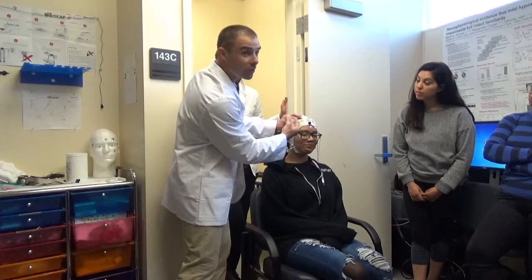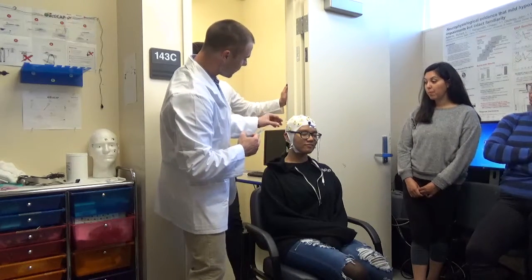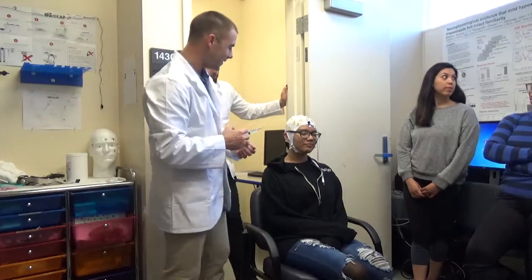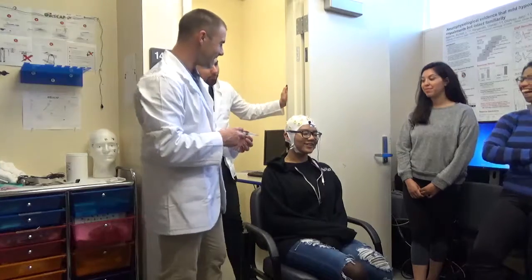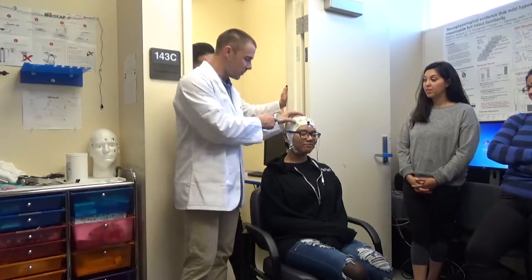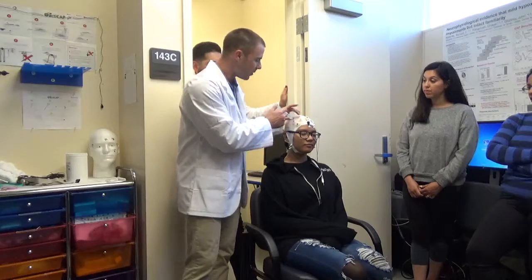So we're going to hold this there, and you're just basically going to fill up a little bit of gel. Now you want to talk to them, especially at first, and say, okay, I'm about to do this. It's going to feel a little cold and goopy. Do you feel that? How does it feel? I have no idea. It's weird. Okay, so you fill that up, and now notice how the gel is coming right up to the top there? It's a pretty good amount.